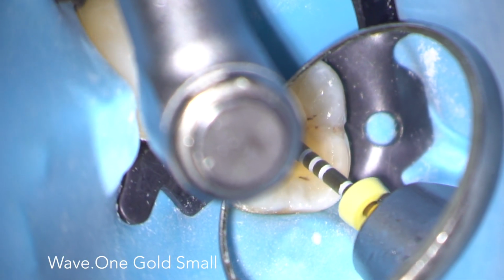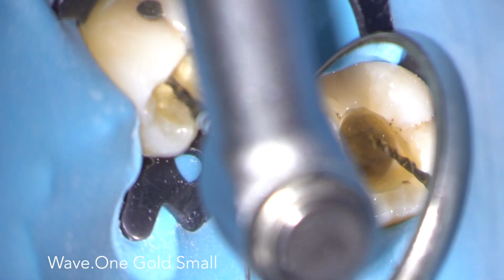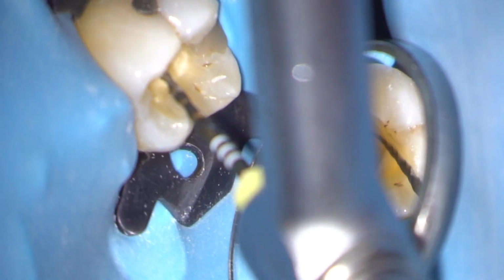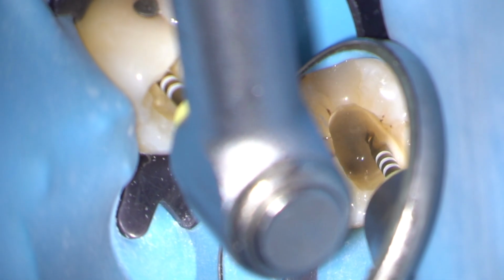One of the great things about working through an access cavity filled with sodium hypochlorite is that as you withdraw the instrument, lots of the dentine chips are dispersed into the pulp chamber. They're obviously very easily removed from there. It also means that you can sometimes prepare more than one canal in sequence without having to take the instrument out and clean it separately.